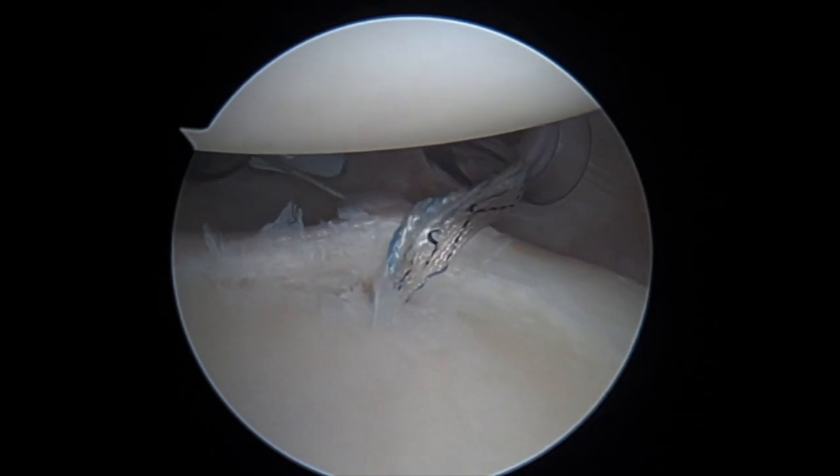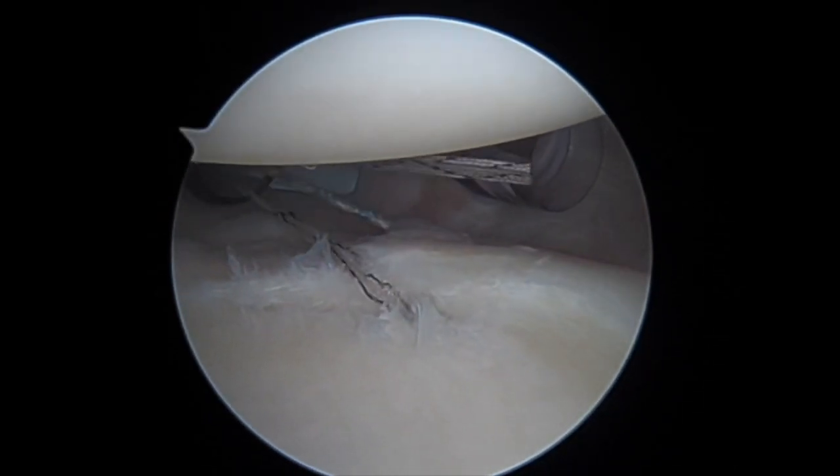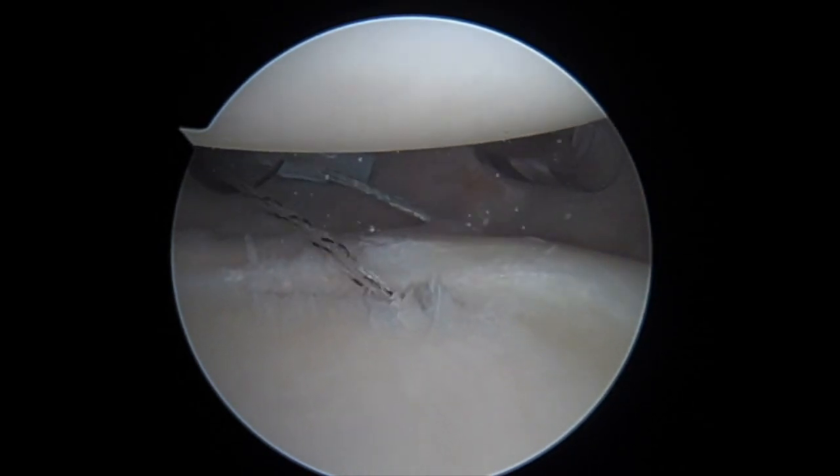After the labral repair stitch has been shuttled, the labral repair stitch can then be passed through the knotless mechanism of the anchor and tensioned down appropriately.